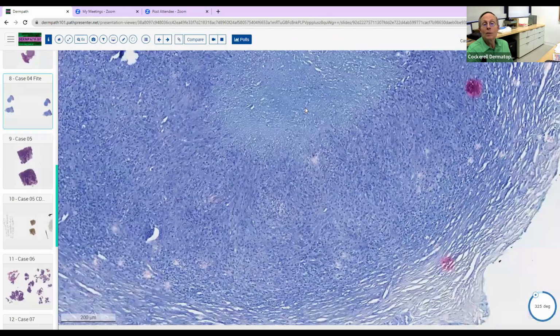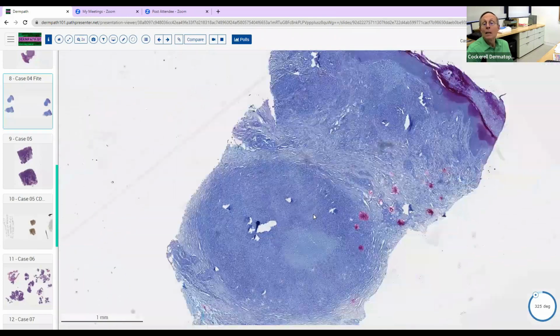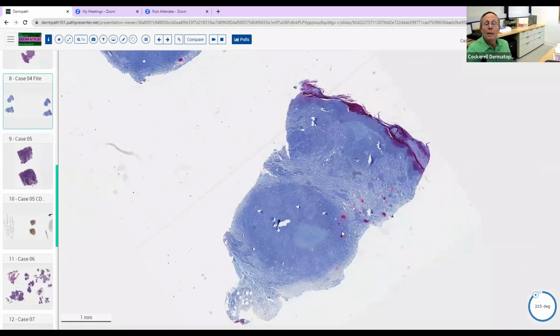It's a good example of caseation necrosis. Remember, the differential looks better for AFB when it's got this caseation pattern as opposed to a deep fungal infection.